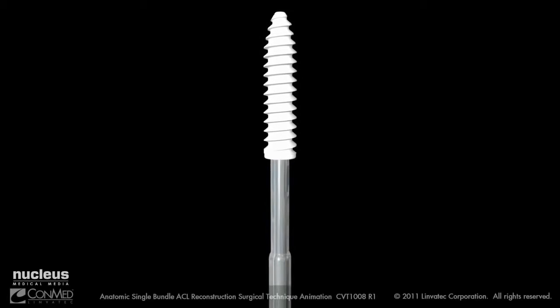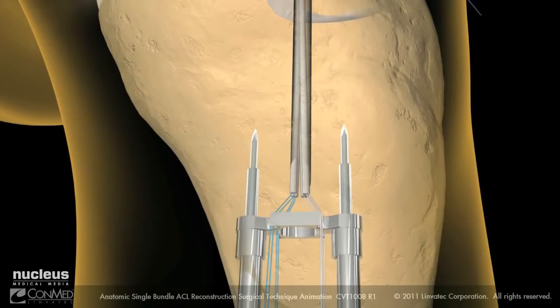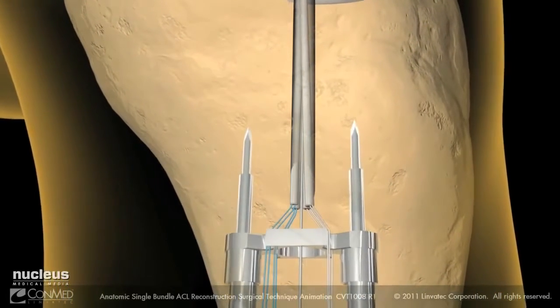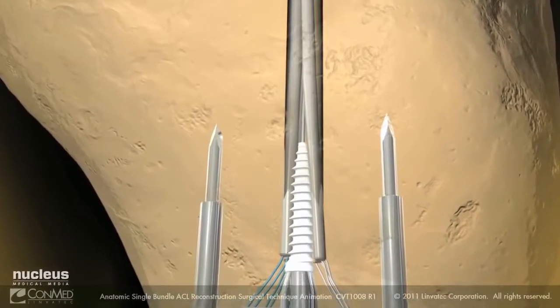Next, load the appropriately sized Genesis matrix onto the tri-lobe driver. Ensure that the knee is in 15 degrees of flexion. Advance the Linvatec BioScrew Hyperflex guide wire into the tibial tunnel and in the center of the 4 graft bundles. Load the matrix screw and driver onto the guide wire and advance it through the tensioner and into the tibial tunnel until it is flush with the external tibial cortex.